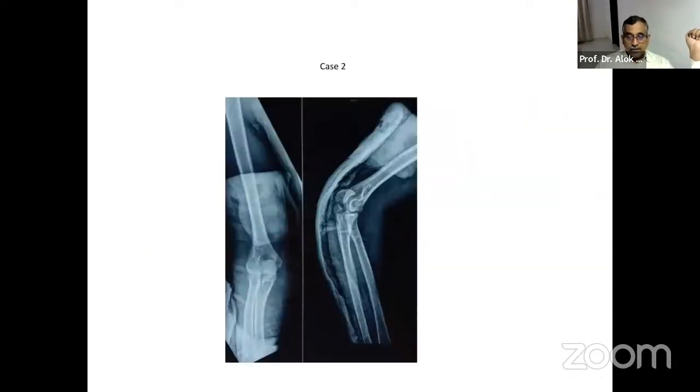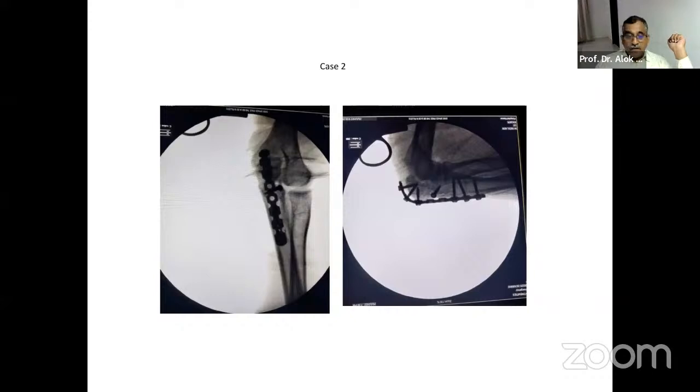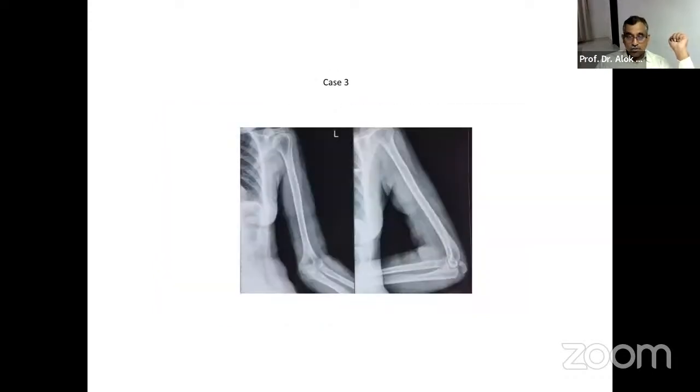Now here you can see there is a fragment and there is another fragment in between of the articular surface and down. So this means this is now getting complex. It is difficult to be treated. And so you will have to learn how to reduce it and how to fix it. And we are having very good plates nowadays. But this is the old X-ray where you could see that a lag screw has been put to reduce the fragment, achieve the intra-articular alignment, and then a recon plate has been used to keep the contour maintained. And of course, this also, once you extend, will be impinging into the olecranon fossa, and there may be little extension remaining. But the fracture has united well.